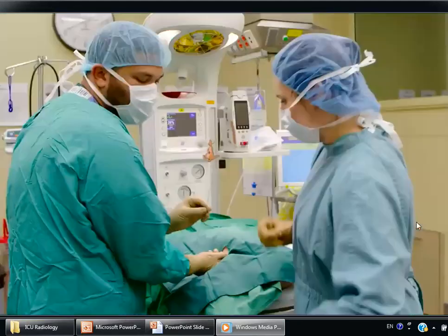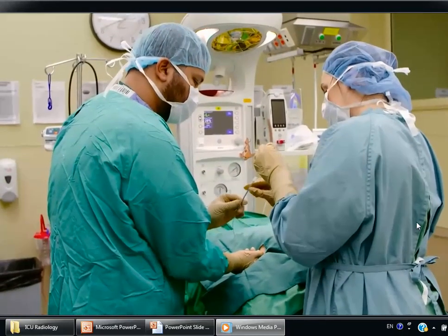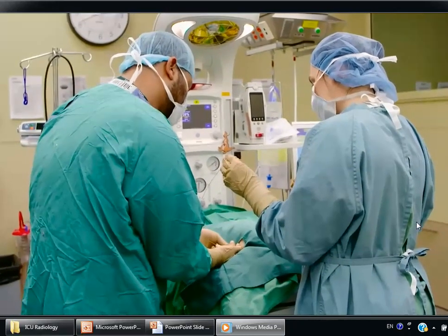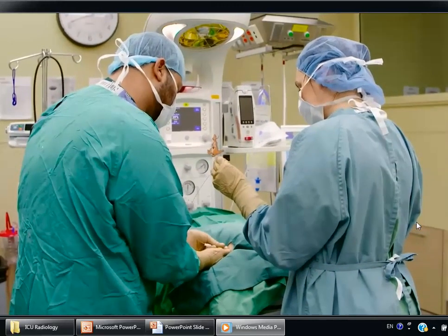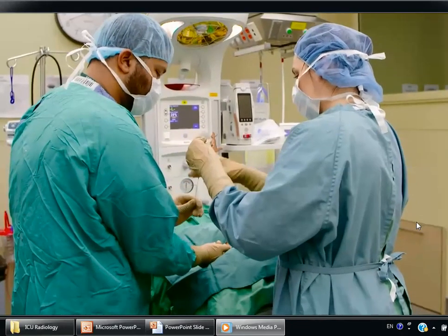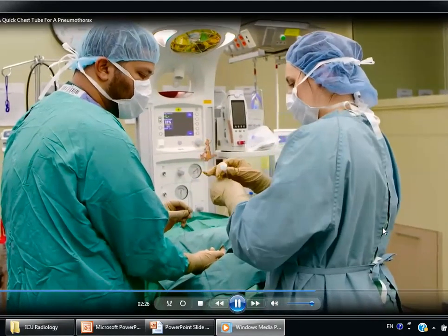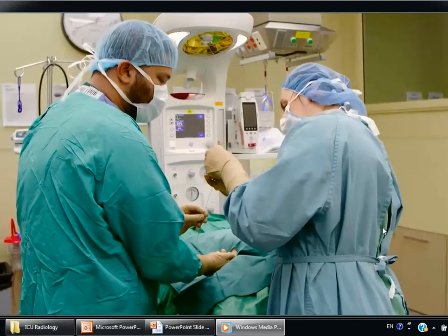Bigger size. Pass the larger dilator along the wire, through the skin about 1 centimeter, angling anteriorly, and then remove. Okay. So can you grab this chest tube? Insert the chest tube over the wire and into the infant just until the holes on the chest tube are inside the infant.